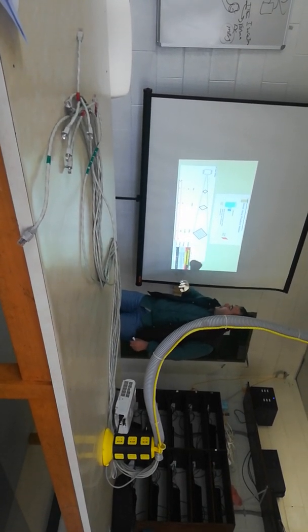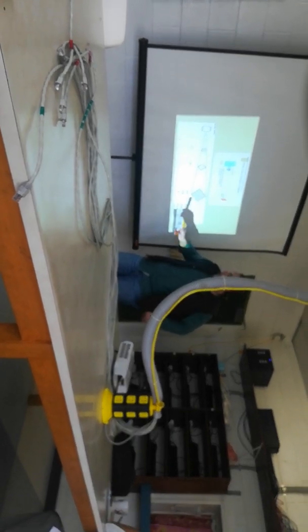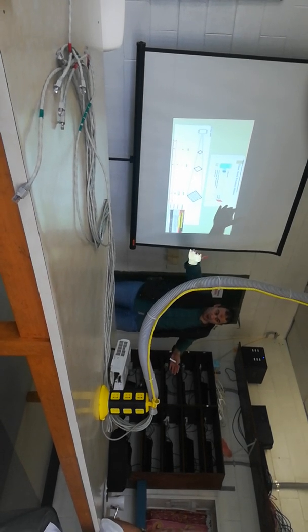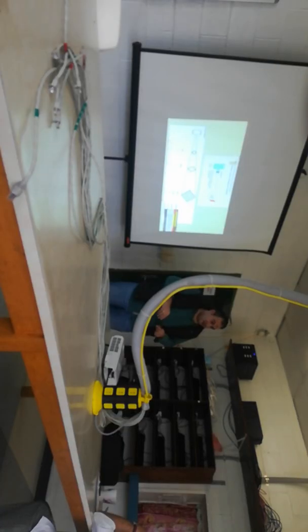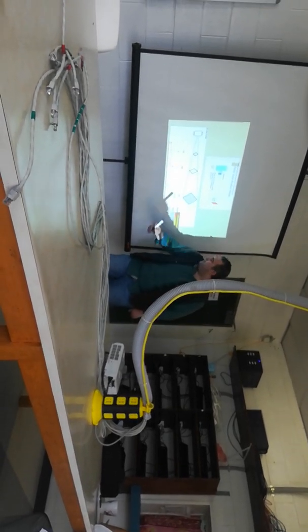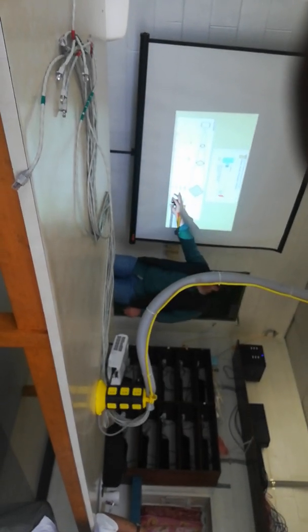So you will find the dose here is different than in this area. If you expose a large area, the dose will be decreased. Here the distance is 50, here 100, here 200. So here you find the dose is 4, here it decreases to 1, here 0.25.